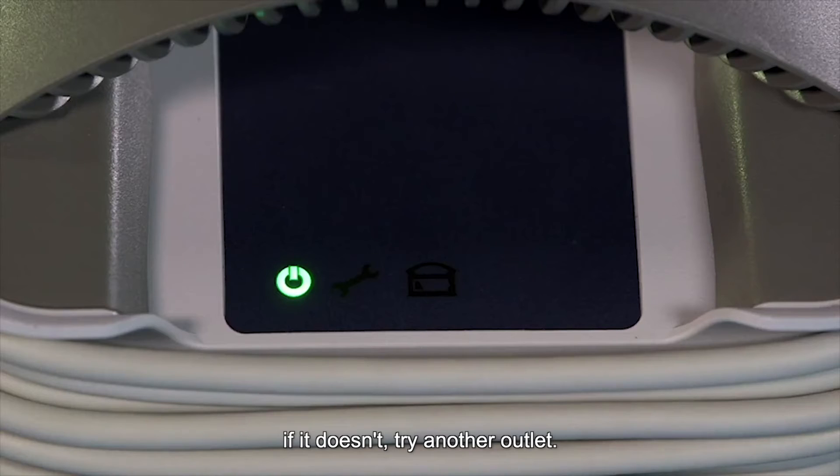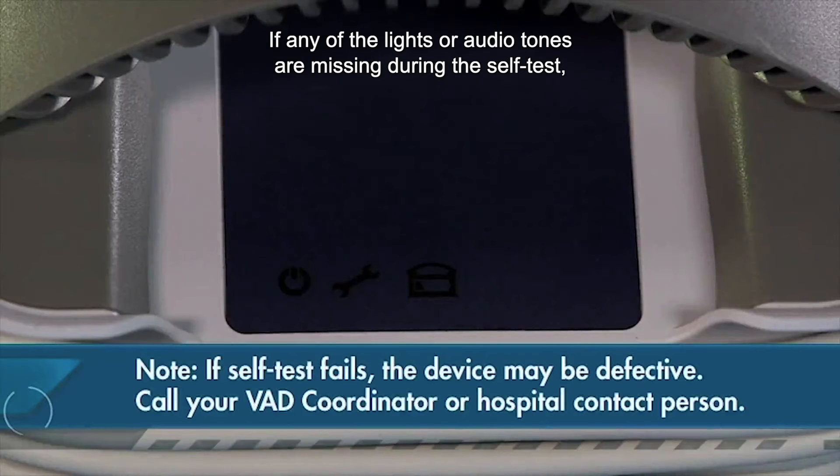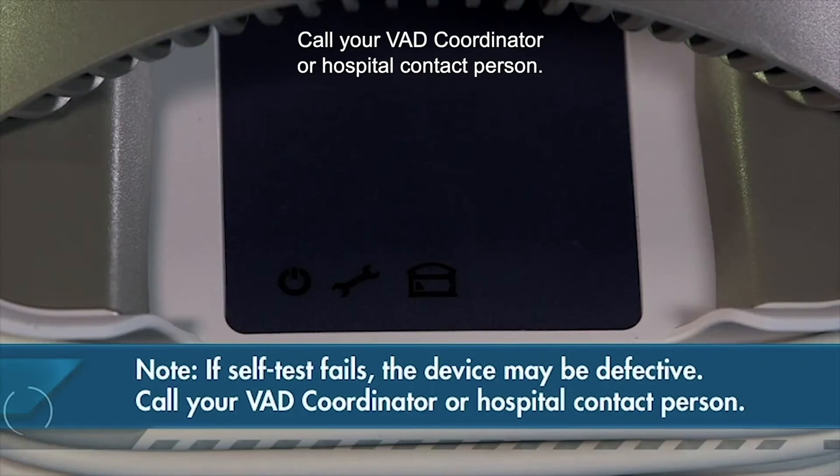If it doesn't, try another outlet. If any of the lights or audio tones are missing during the self-test, or the green power on light does not come on, do not use the device as it may be defective. Call your VAD coordinator or hospital contact person.